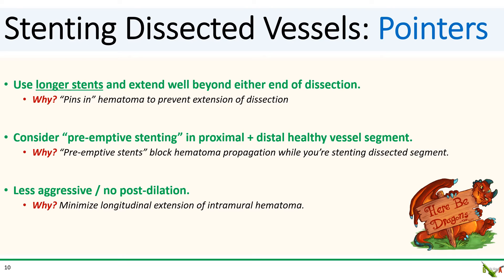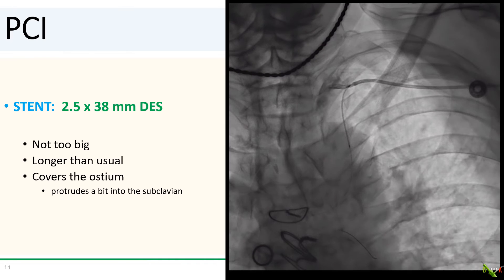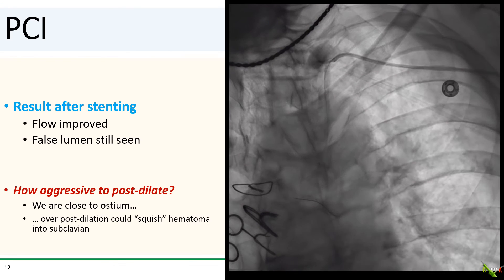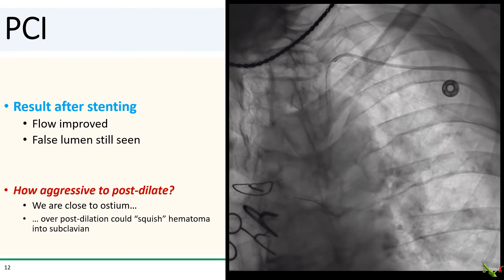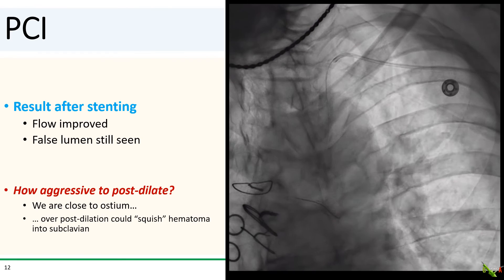As with pre-dilation, post-dilation in the dissected segment should be minimized, and if done, kept at a relatively low pressure. In our case, there was no need for pre-dilation, so we decided to directly stent. We chose a 2.5 by 38 mm DES, which is longer than usual and not too big in diameter. We made sure to cover the ostium of the LIMA and intentionally protruded the stent a bit into the subclavian to reduce the chance of back propagation of the hematoma. Here is the initial result after stenting — flow in the LIMA was improved. We can still see the false lumen, meaning there was still communication between the false lumen and the true lumen.